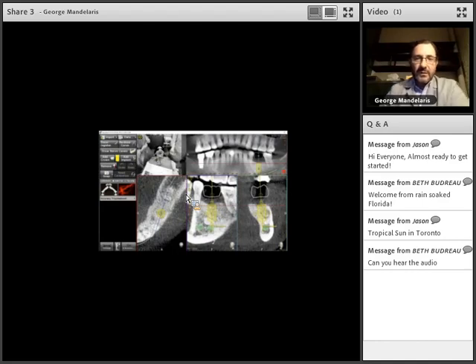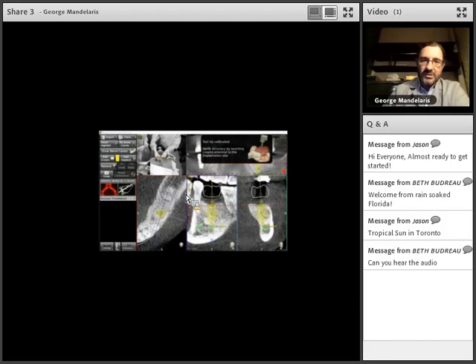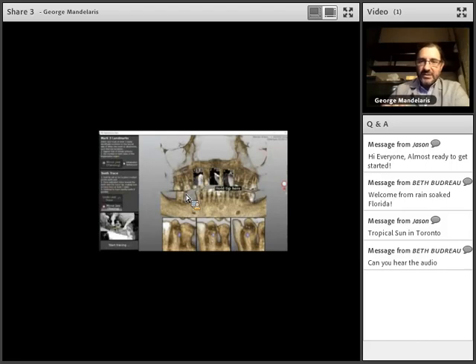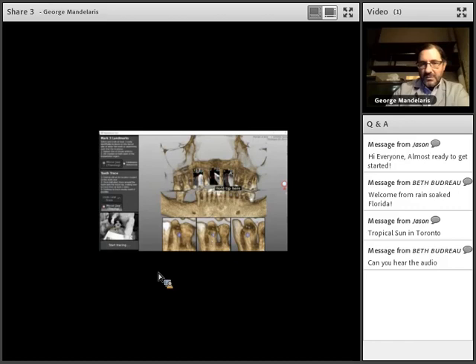I'm showing you her video, and basically what you can see Sylvia doing here is calibrating the tip. This is the tracer tool tip that she's calibrating. She's using the older calibrator, but nonetheless you get the point. So she's calibrating that, and then here are a couple of points that she has indicated that she wants to trace. Once that's been registered, she's going to go ahead and use those 3 teeth to trace.